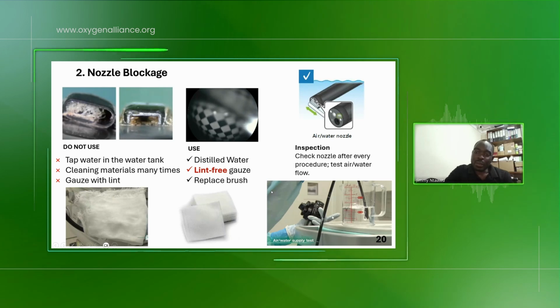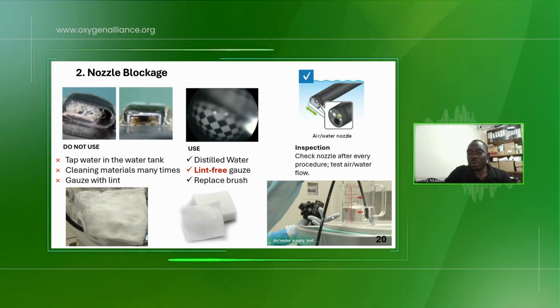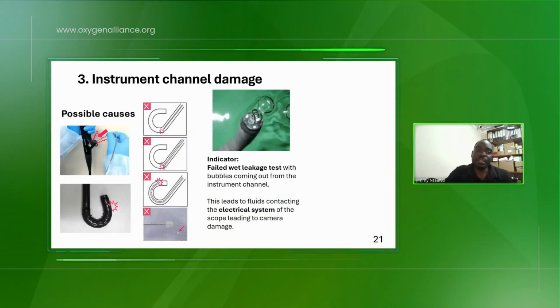Yeah, so another thing we do is we do the inspection of the nozzle each and every time we are going to use the scope. So you test the water, you test the air, if they're working very well.